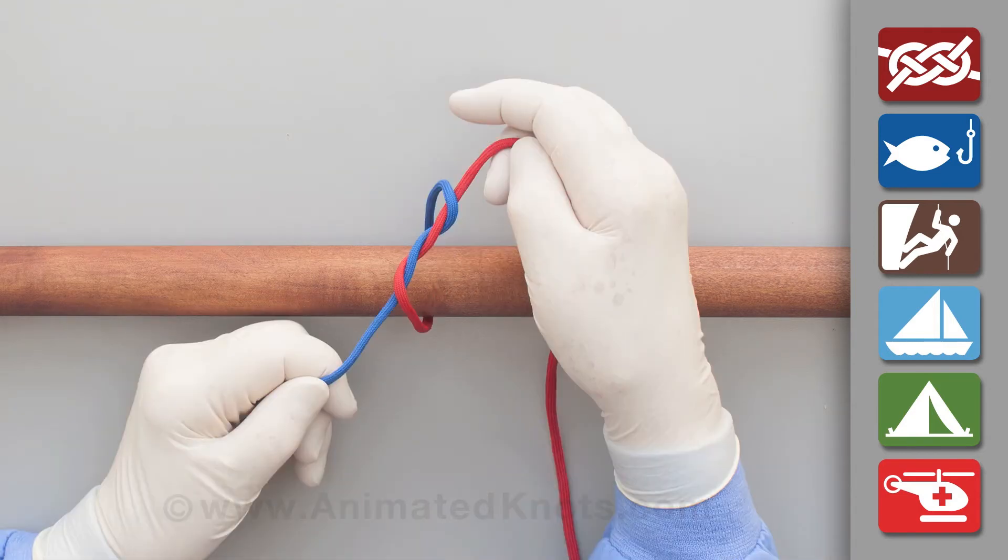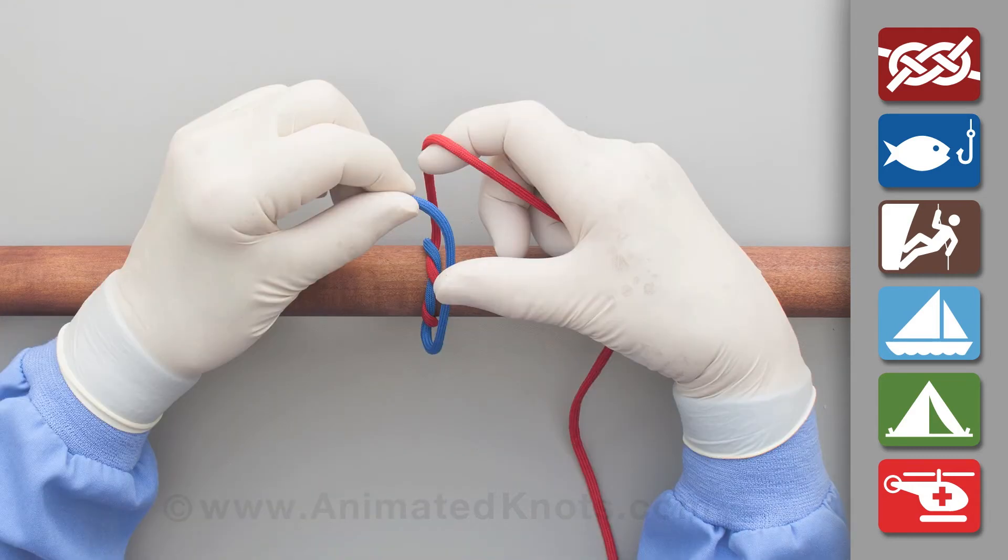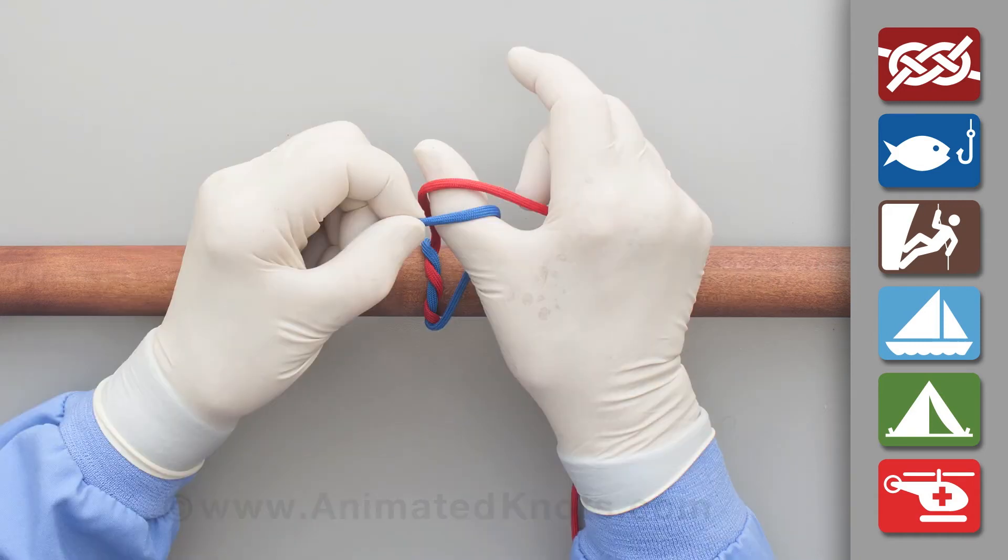Pull this double throw knot tight and maintain tension on it during the next stages. Insert your thumb between the two ends so that, again, they cross in opposite directions.